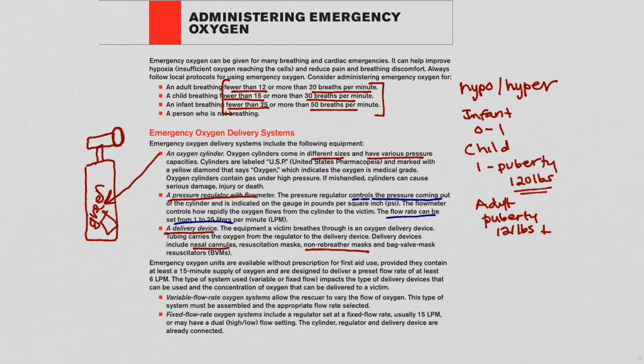Keep in mind as we go through this lecture that a higher flow rate isn't always better. So I would say err on the side of caution and err on how your patient is able to actually respirate at that particular time.